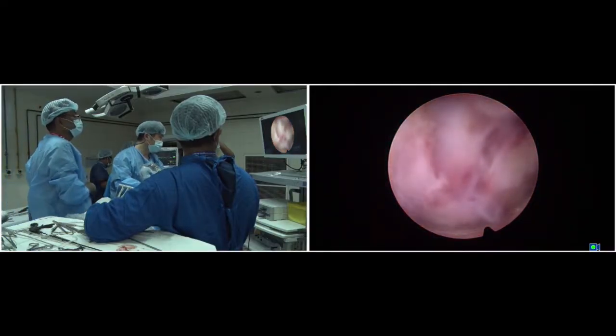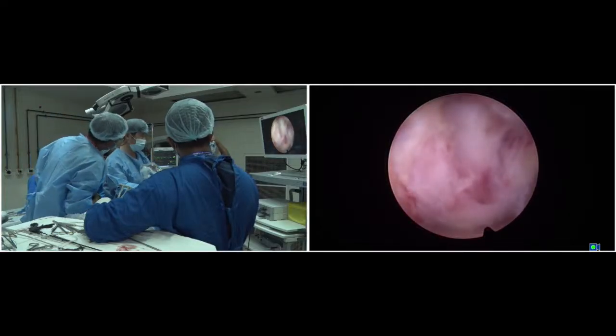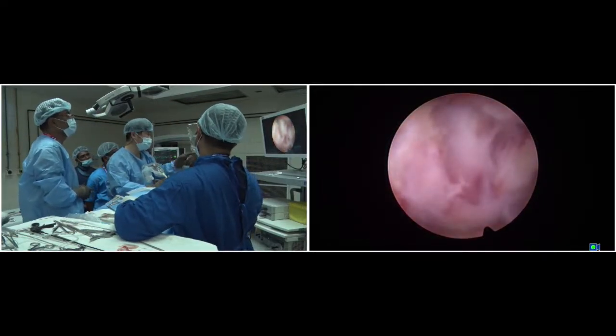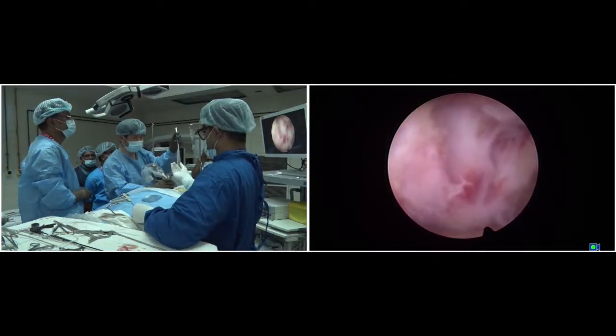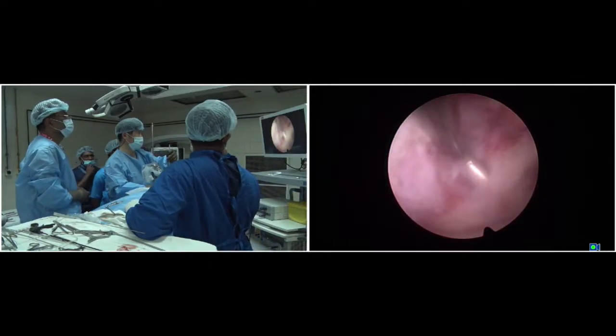I already mentioned that this is a big size disc, traction is very dangerous, because I'm only doing a partial pediculotomy today. Partial, if needed, with a probe. Usually I'm doing it with a probe. Inserting a small working channel to here, and then it is possible to retract to here.